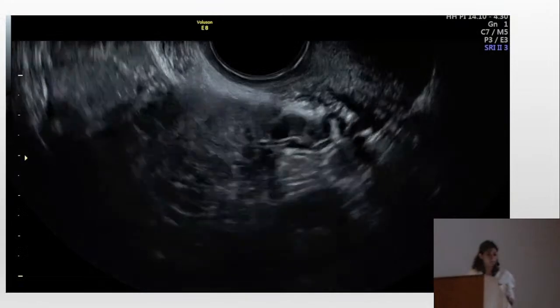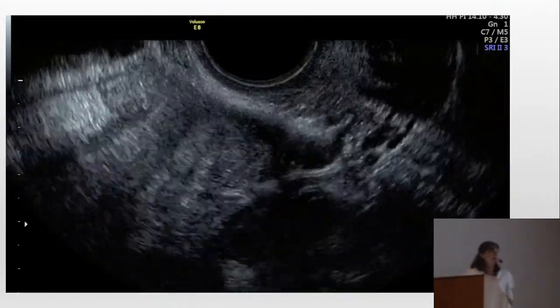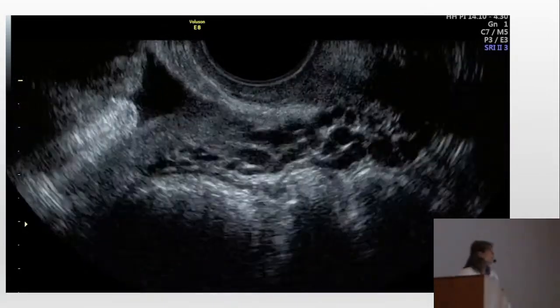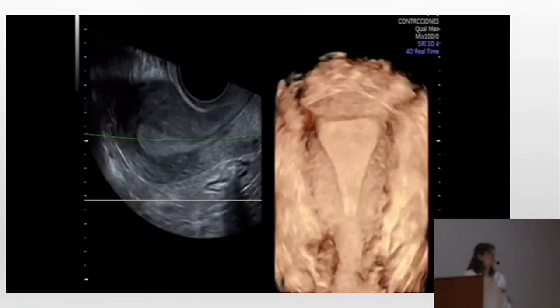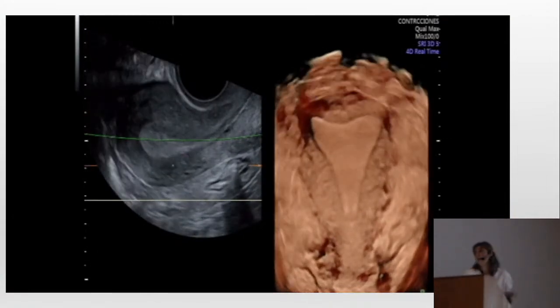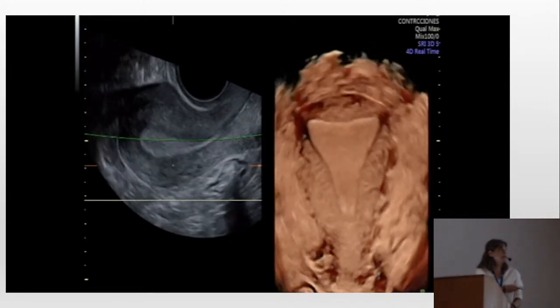First, the 3D. It's like we taught you, this is the sweep, and we see the coronal view. We are confident. Then we place the patient in semi-supine position, and this is already the video after we processed it. Okay, and we can see the contractions.